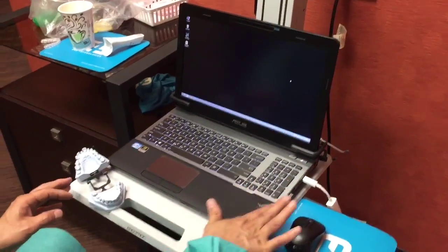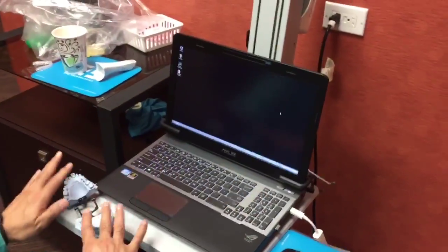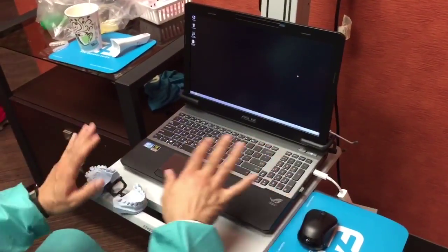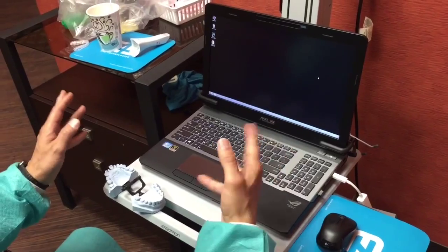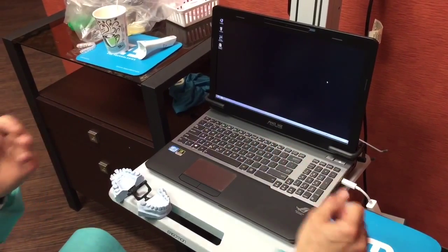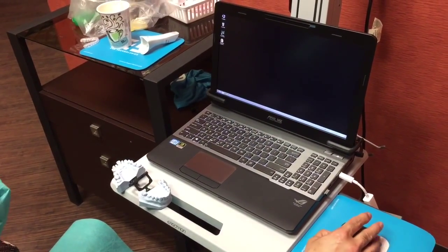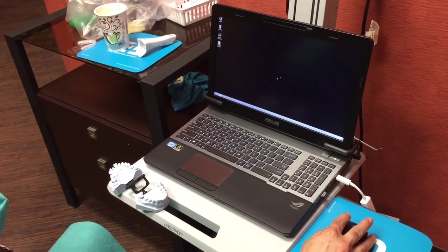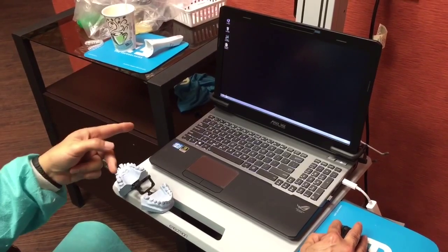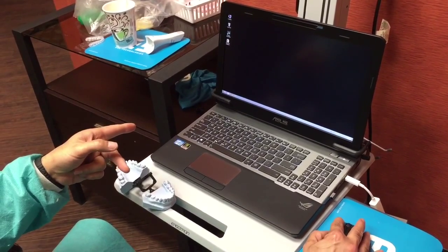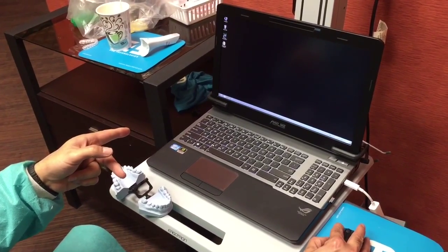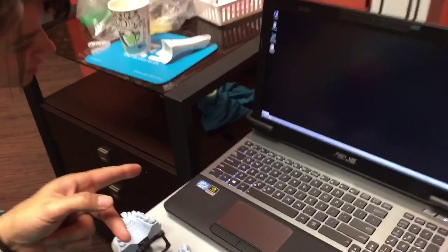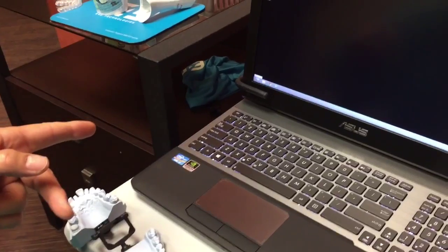First of all, this computer is only to be used for E4D. You don't go on the internet or nothing because you could get virus or you could damage it. See that little icon here? That's the E4D Design Center.